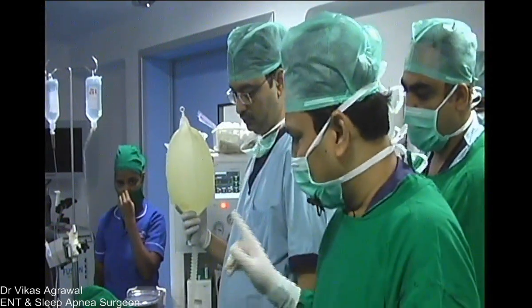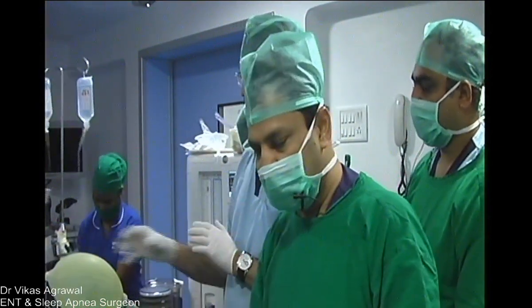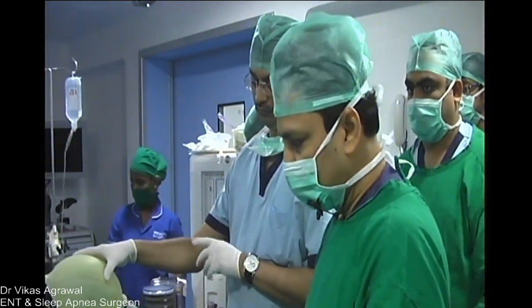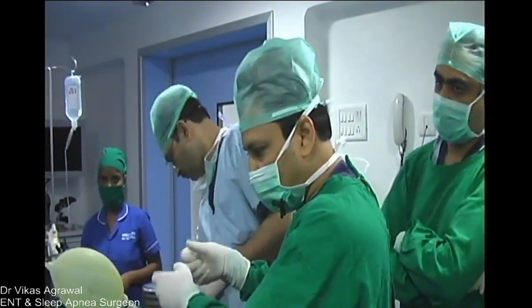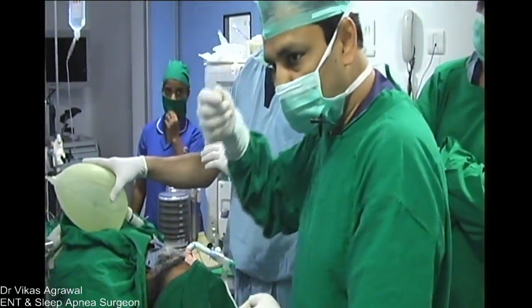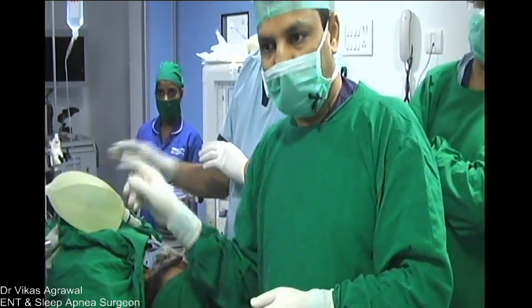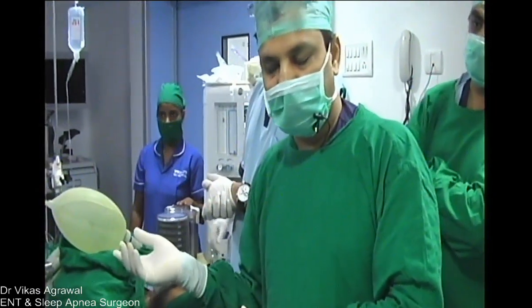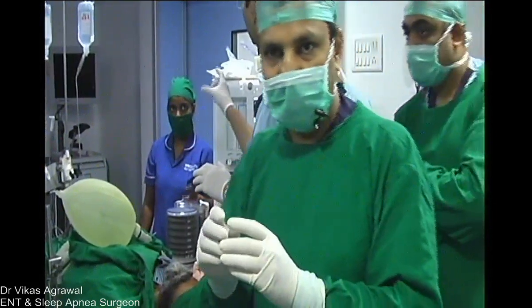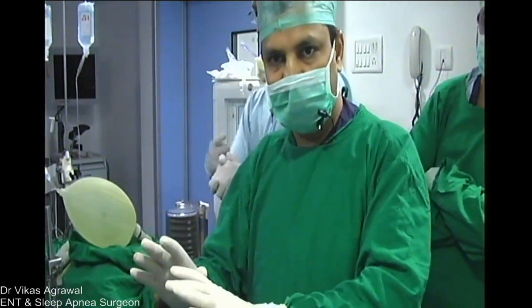So now, if Kalpesh has any difficulty with extubation, what all can he do? He can lift the jaw, give a CPAP. He will keep the nasal airway. Apart from that, he can always push an LMA again, right? We know that on LMA, he could ventilate the patient very well. LMA is a very soft thing. His anatomy is good, so it will go and fit onto his larynx.